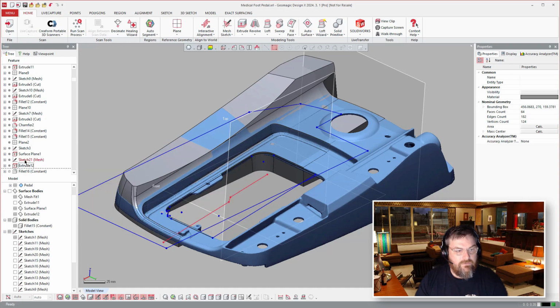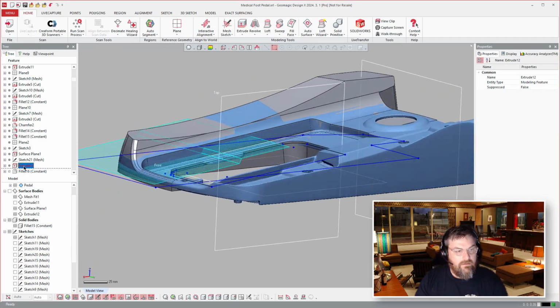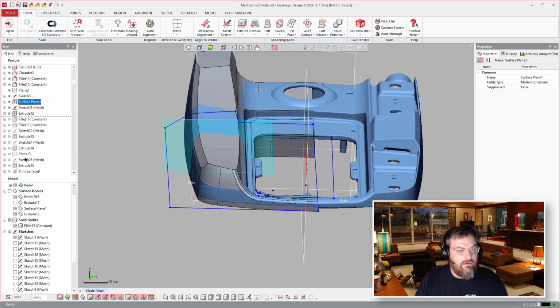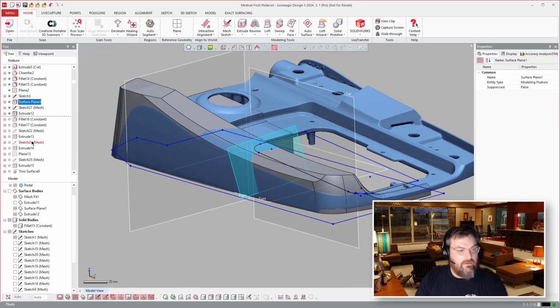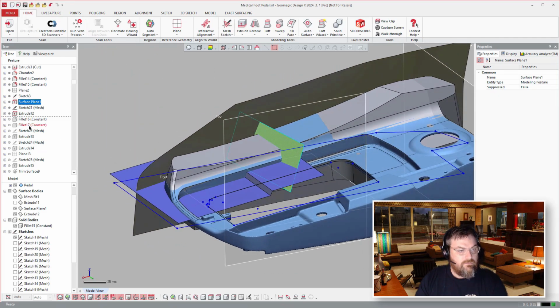which is really neat here. We'll just highlight this one. Surface there, surface here. And I'll turn those on so you can see them. And then we'll go forward a few more. It looks like we're going to do a kind of a complicated surface trim to each other.